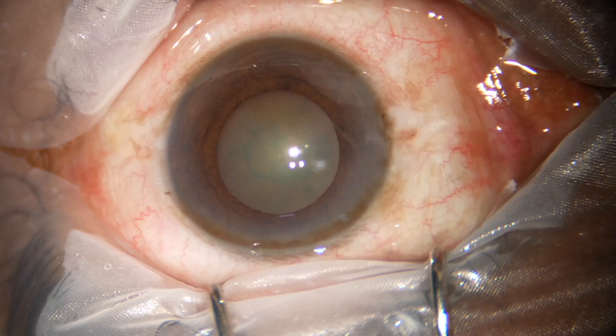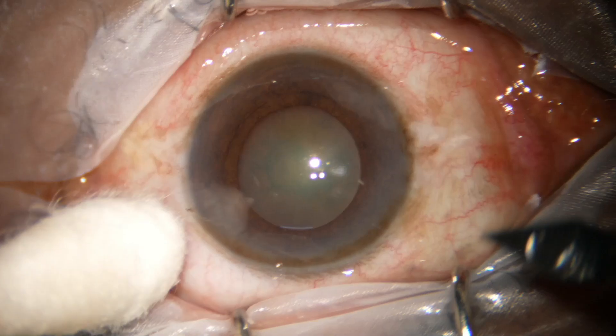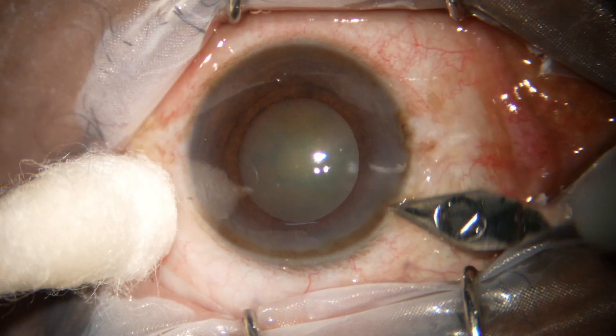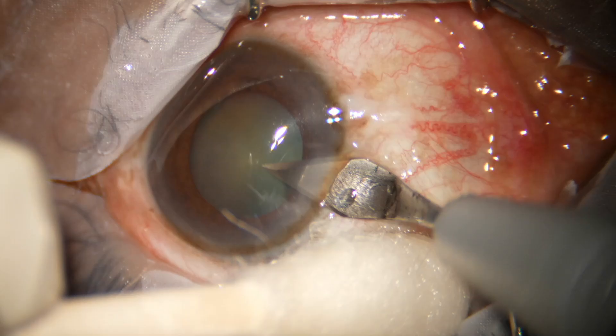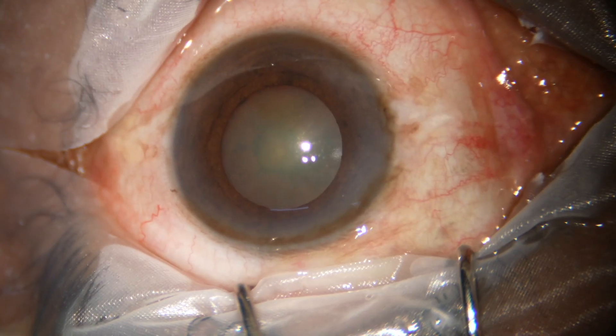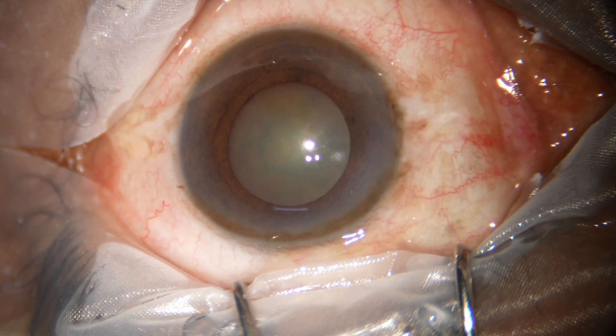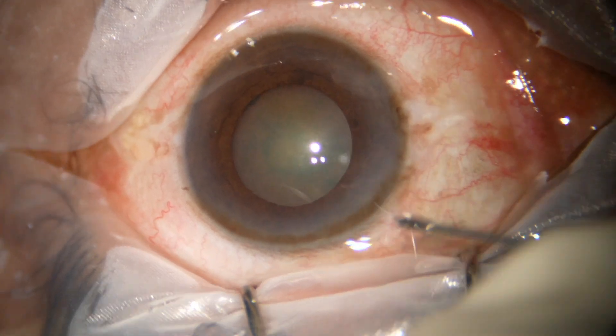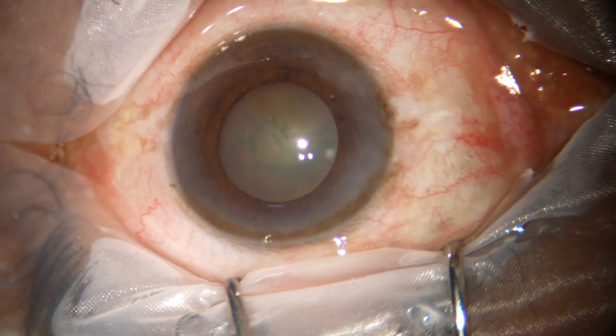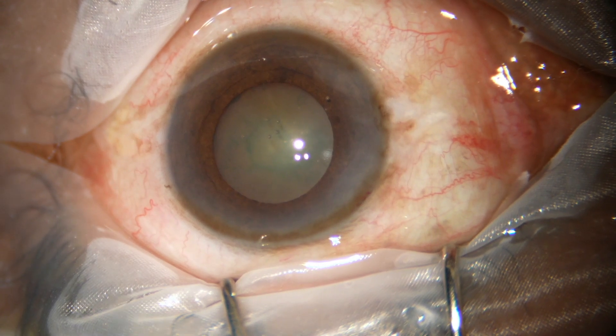Friends, this is a cataract with grade 2 nucleus sclerosis. The pupil is not well dilated — we can say mid-dilated. The size of the pupil is about 5 mm. But during emulsification of the nucleus, these kind of pupils usually come down further and surgery becomes difficult.